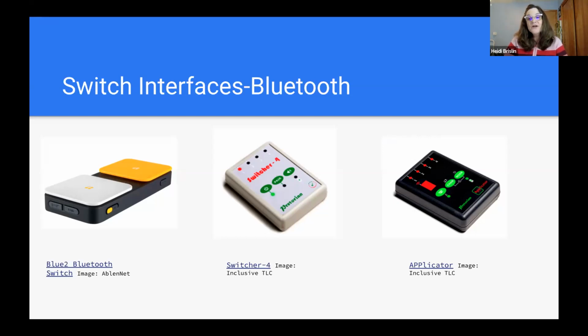So on the Chromebooks, as much as you can, you certainly can use these Bluetooth ones, and if you have a really competent team that can muster through things, they're fine. But on the Chromebooks, because they're relying on so much internet stuff to do what they need to do, the ones that you plug in seem to work a little better. Does that make sense?